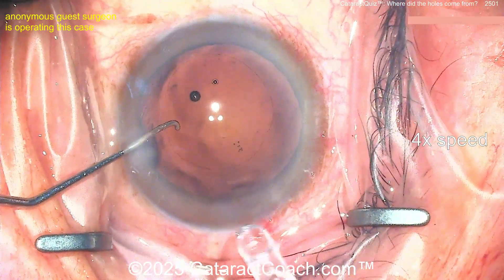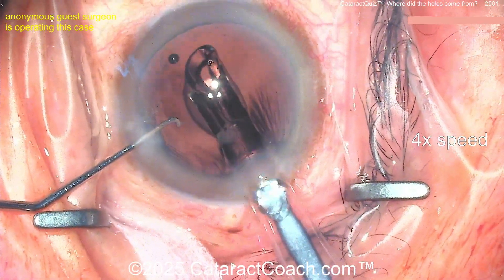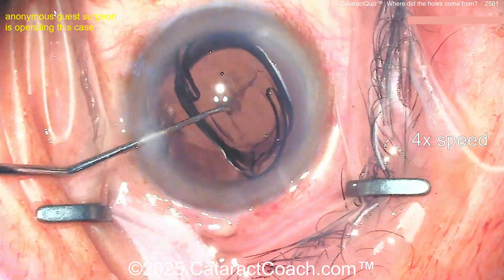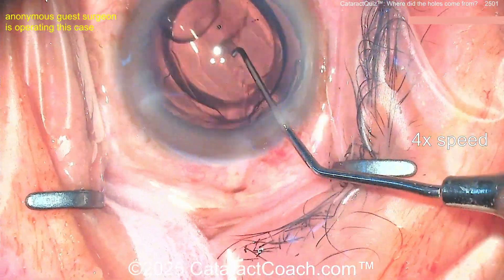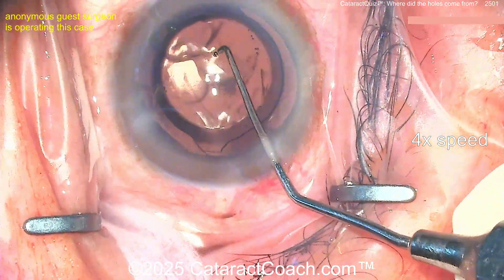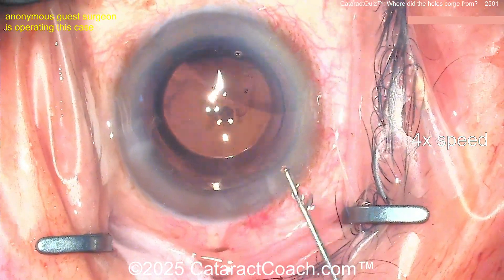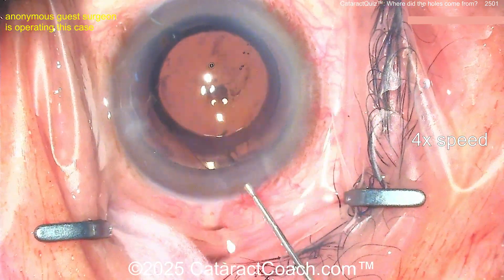Widening up the incision with the diamond — good. Let's get the lens in; you can probably put your lens right in the bag — your regular lens. Just don't have too much manipulation; get it in the bag and slowly open it up. Don't move around too much, just leave it be. Luckily it looks like a non-toric lens, so it can go in any position, nice and easy. Now let's take out the viscoelastic.